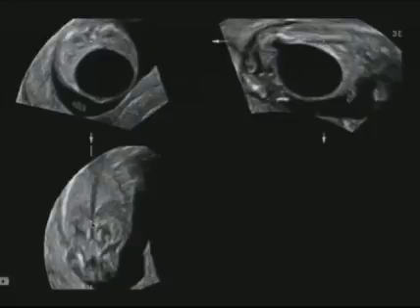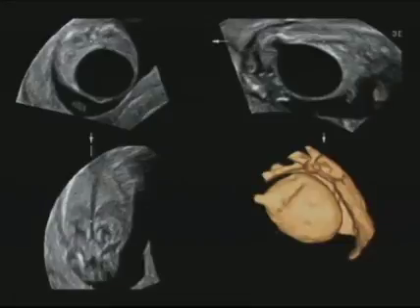So in fact, what these three images show is the bladder and the dilated kidneys in this patient with posterior urethral valves. Now you push one button and you have the inverse mode, and this shows you now the bladder and the posterior urethra very nicely.